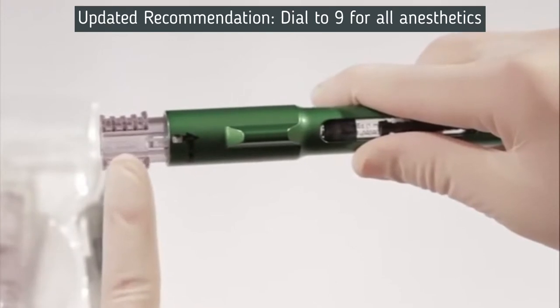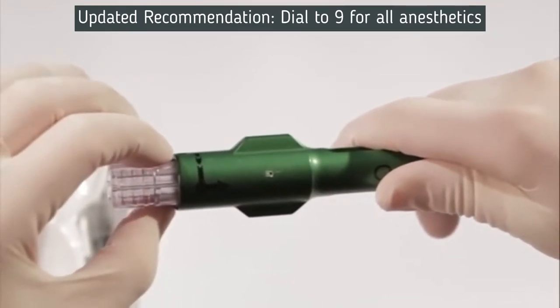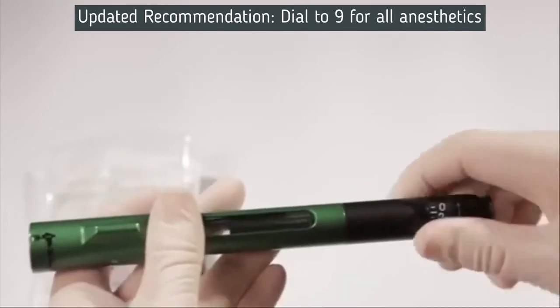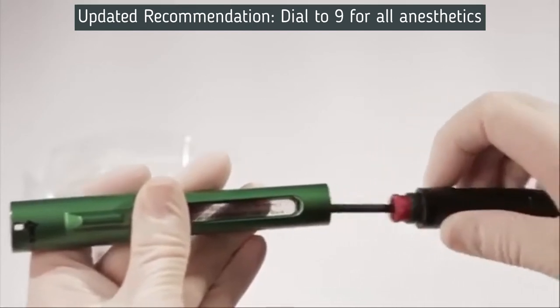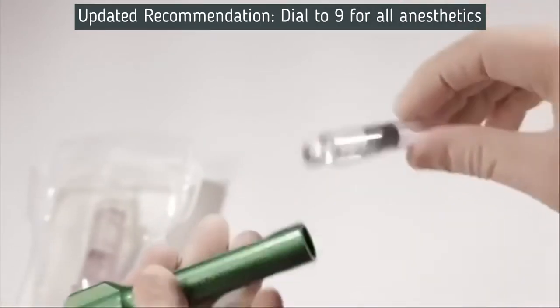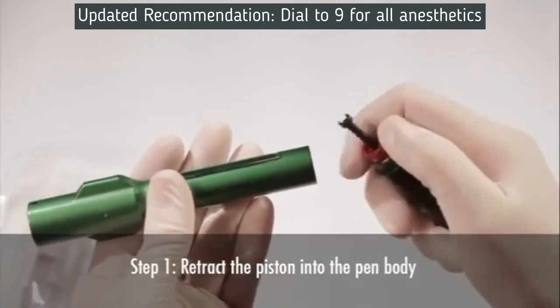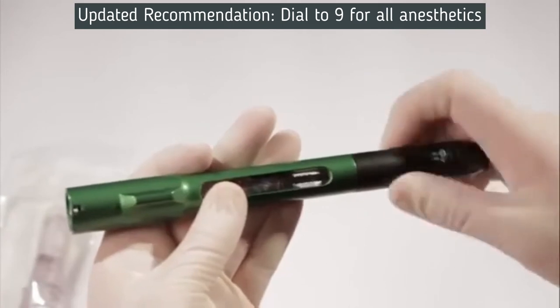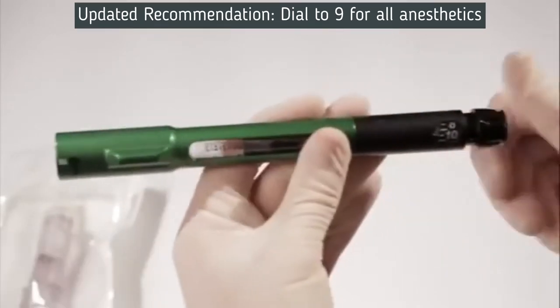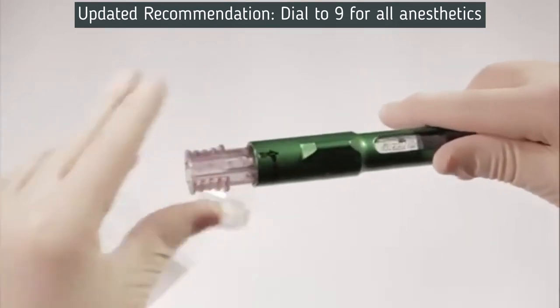To remove the cartridge connector, make sure the arrow on the connector is aligned in the number 1 position on the pen. Push the pointed locking levers on the sides of the cartridge connector in with your thumb and forefinger, then pull the cartridge connector out of the pen. Use caution and carefully dispose of the cartridge connector in a sharps container. To remove the used 3-milliliter cartridge, unscrew the pen and slide the used cartridge out of the pen body. Discard the used cartridge. A new 3-milliliter cartridge may now be inserted. Prime the mixing pen as previously instructed, then attach a new cartridge connector — the mixing pen is now ready to mix solutions.